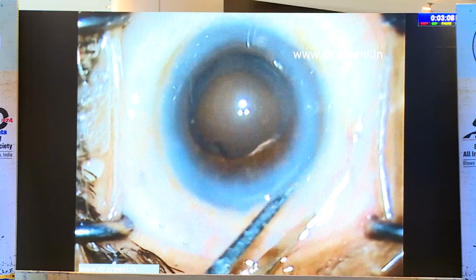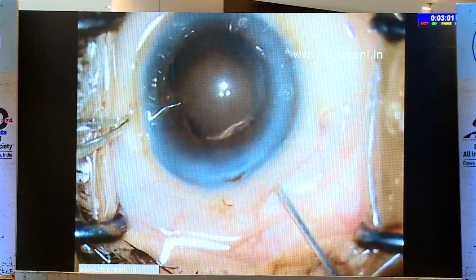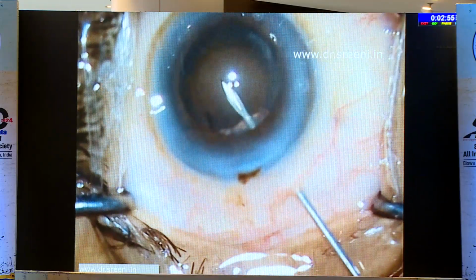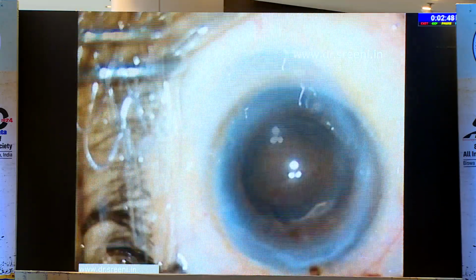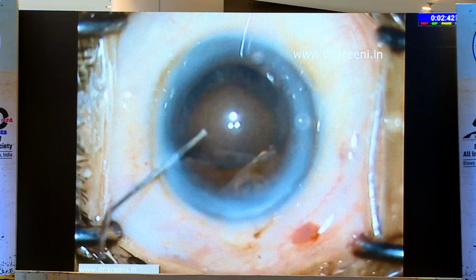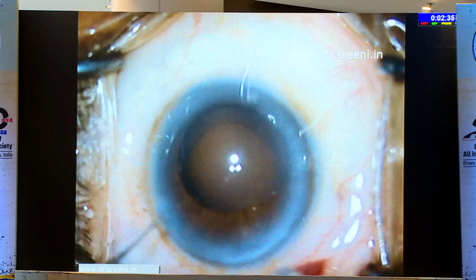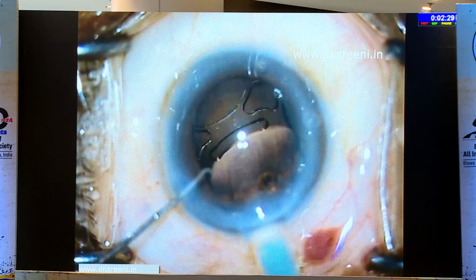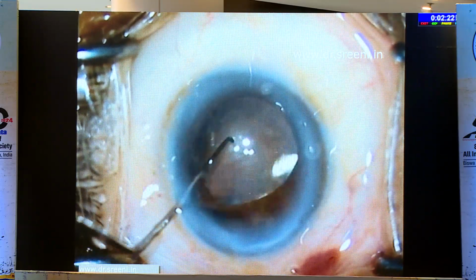What was done was, with a 26G needle through the pars plana, went in to direct it basically to the Berger space, so just behind the PC, and aspirated the fluid. See, here the attempt is to aspirate the fluid, not the vitreous. Once the fluid comes out, immediately the eyeball becomes soft, and see the AC deepens, enough OVD goes in, the eye is soft. So now you can implant the IOL comfortably. The leading haptic goes in, you can comfortably dial the IOL into the bag. You can do aspiration properly.